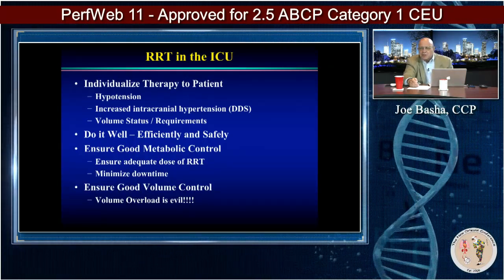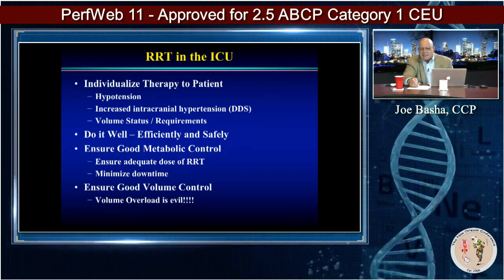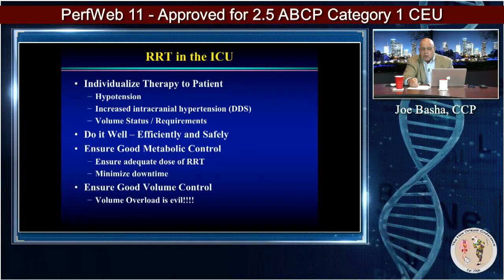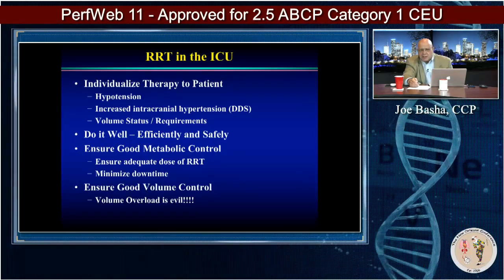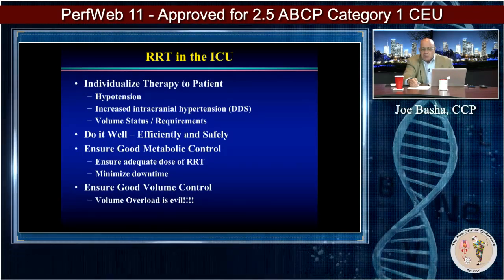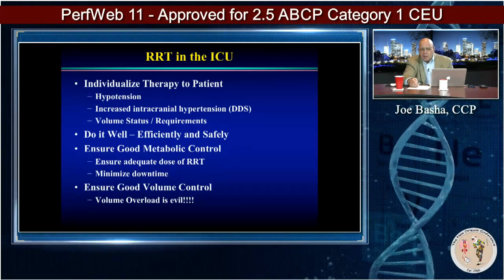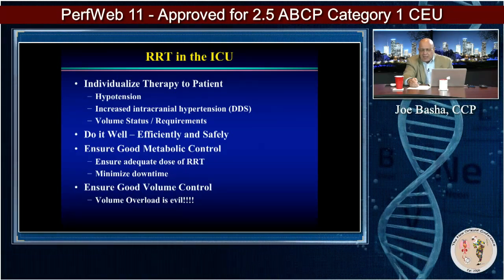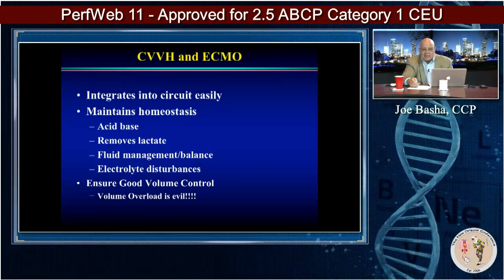You want to make sure you do it well, efficiently and safely. You want to ensure good metabolic control, ensure adequate dosing, minimize the downtime of the therapy, and ensure good volume control. Volume overload is evil. And I'm going to say that twice. I'm going to actually add that in this next slide.